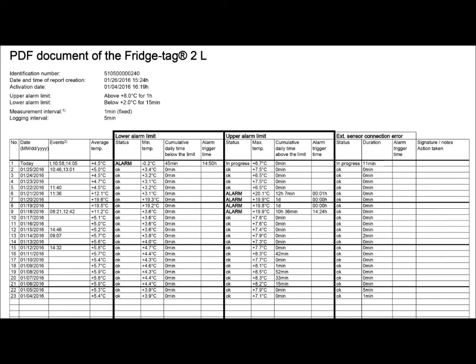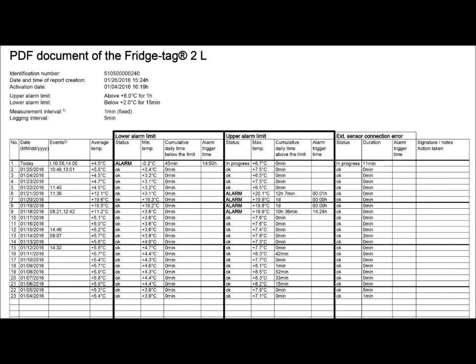The far right hand side shows how long the external sensor was disconnected from the data logger, and we can see that it was 11 minutes today while we were generating the report. If it is disconnected for more than 15 minutes, the OK will change to an alarm.